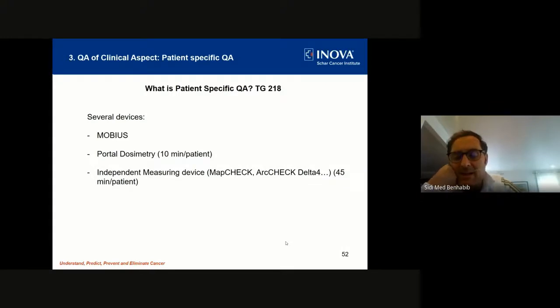Basically, the independent check will tell us if our outputs are stable or not, or if they are within the criteria where they should be.